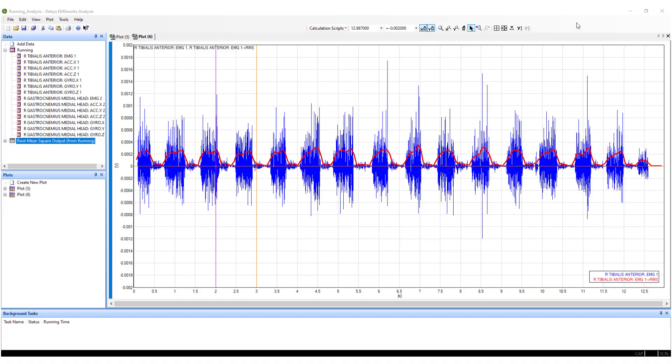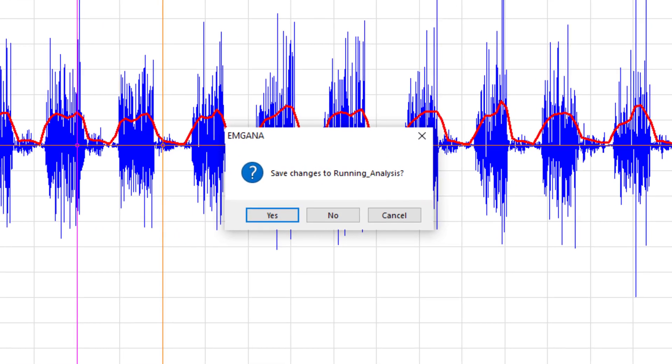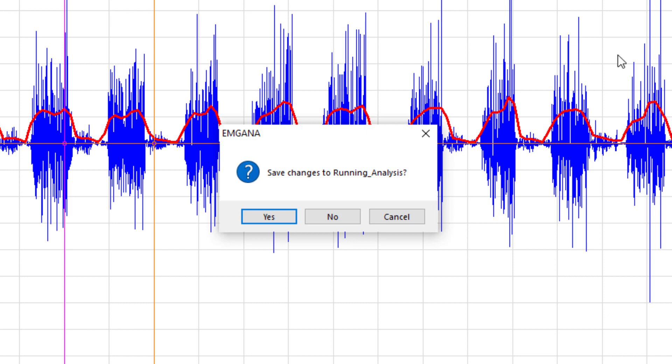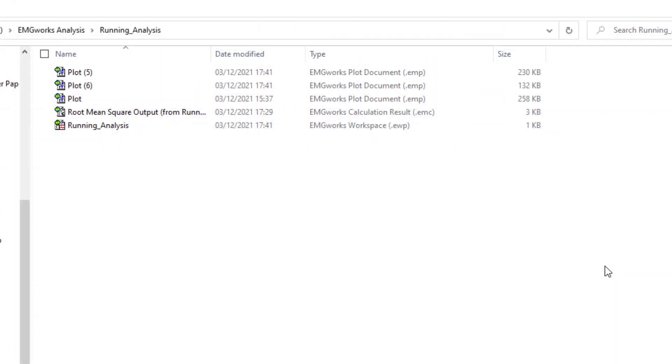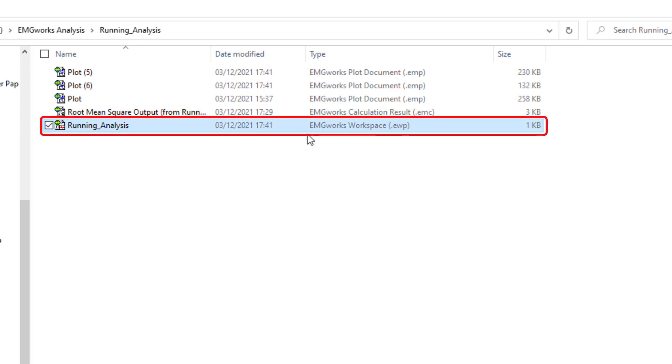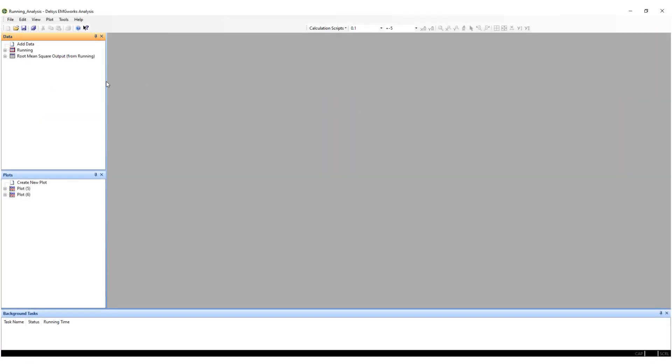Once finished, ensure that all calculations and plots have been saved. To return to a saved workspace, open the EMG Works workspace file from the stored directory. This will store all previous calculations and plots.